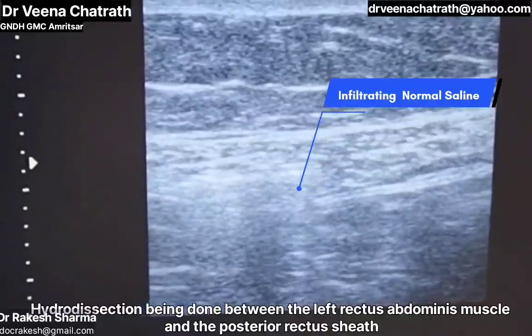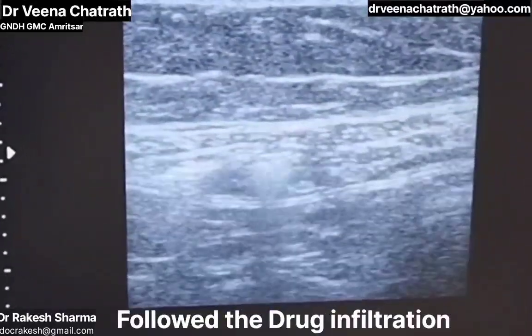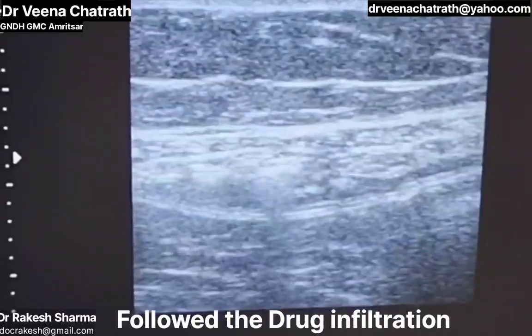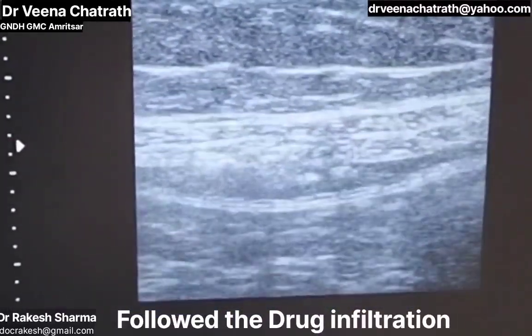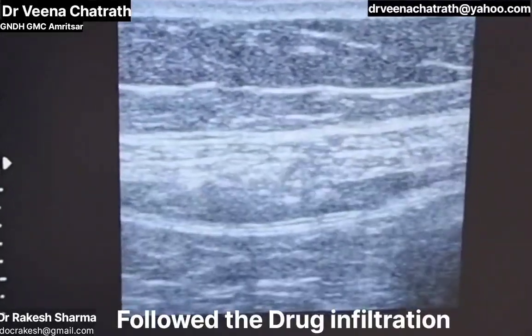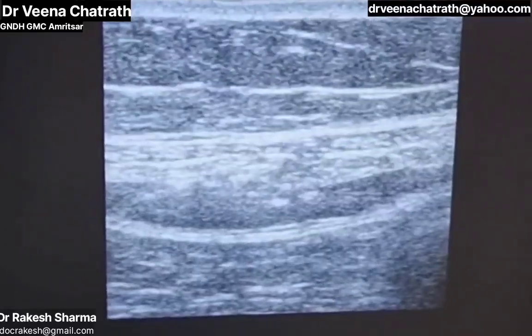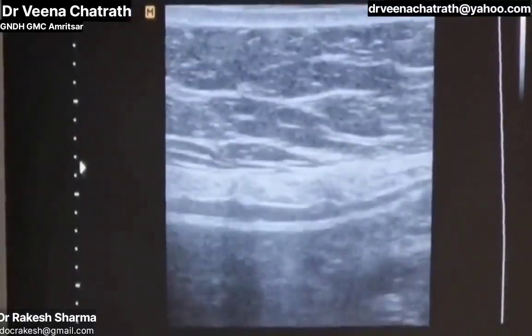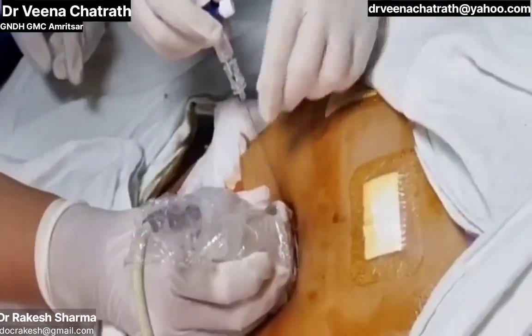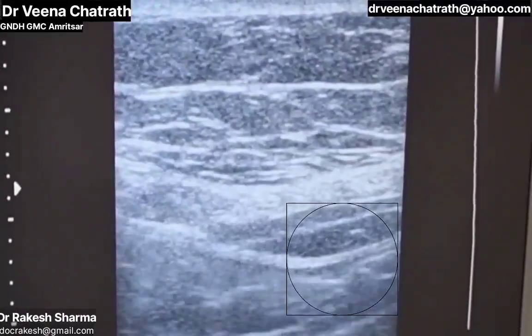Now we will be depositing another 10 ml of 0.25% levobupivacaine with butorphanol. We can see the hydrodissection and the spread of the drug in this plane. We can see the spread of the drug also in this plane.